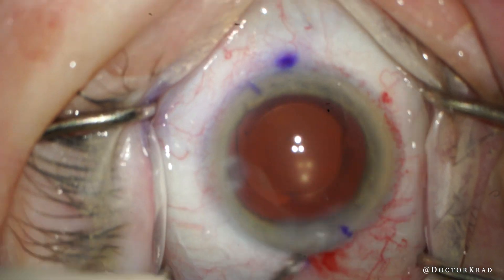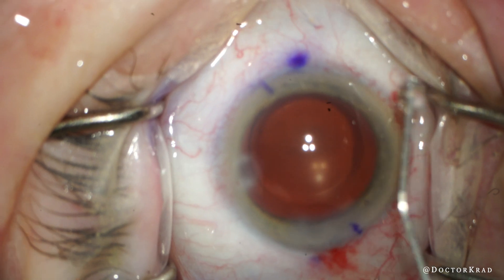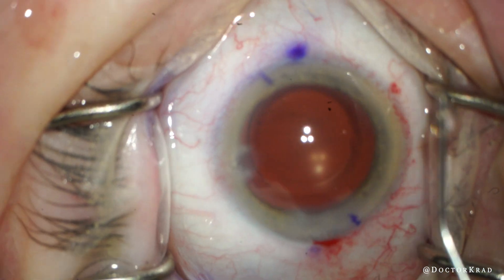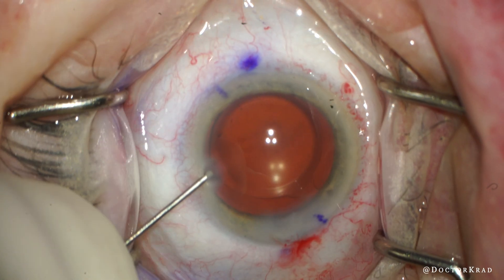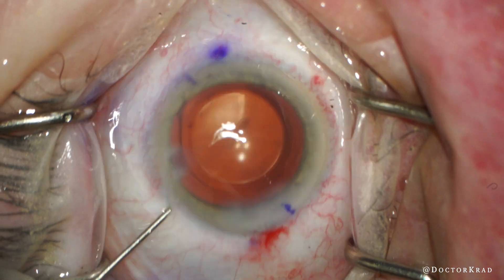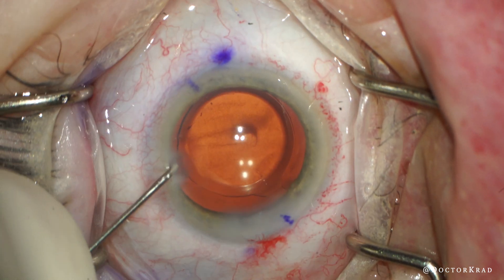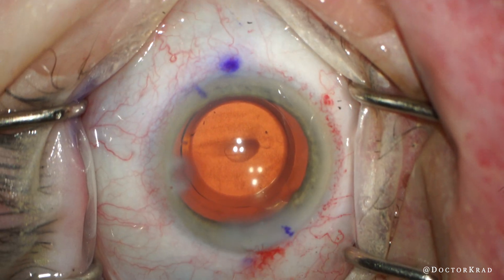I speed up the video here to save you some time, but I'm repeating the process of gently irrigating the AC — a very gentle stream so as not to disrupt the source of the bleed. Do you notice the underlying diagnosis yet? It's in view, so if you don't, I'll tell you in just a moment, but I'm sure most of you already know.